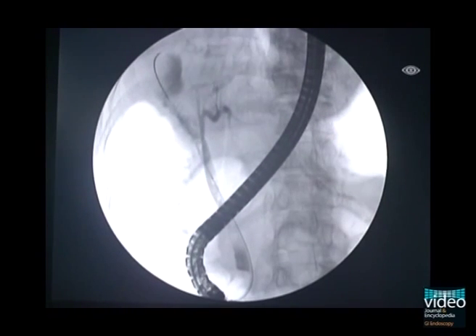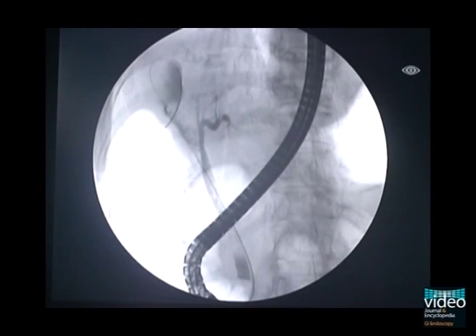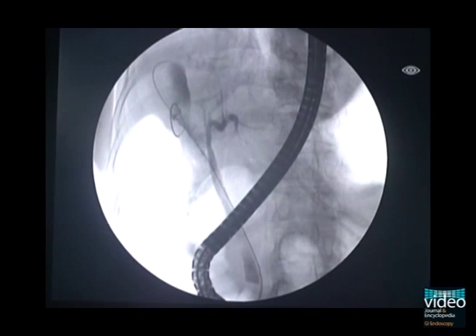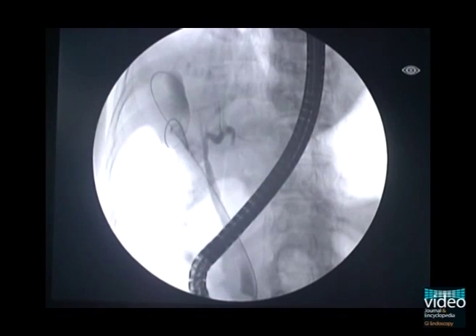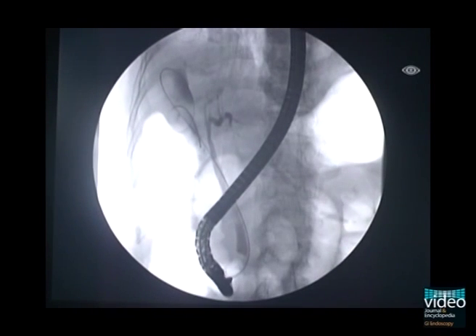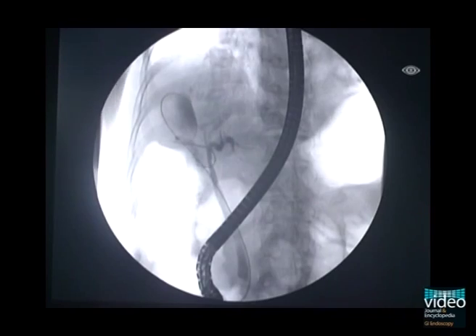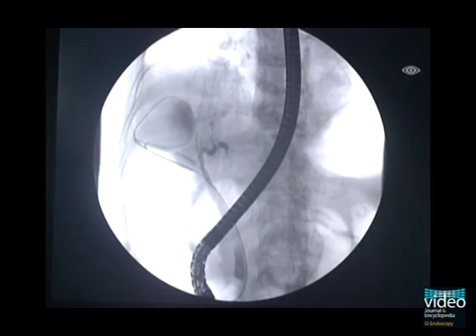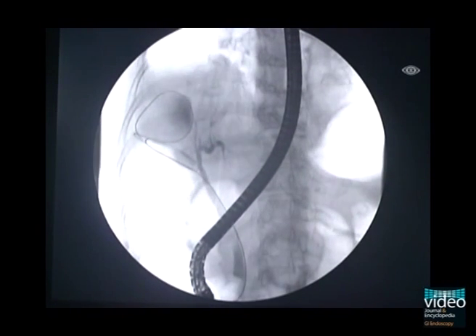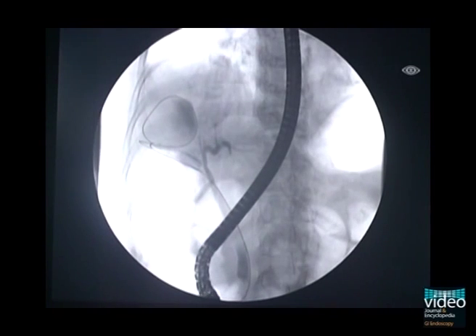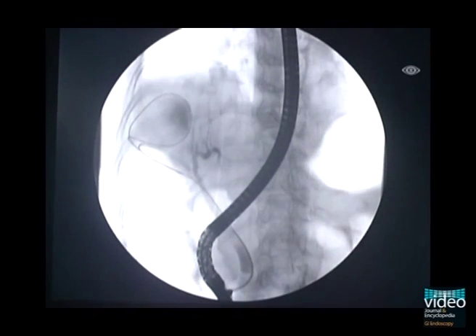In this case, we attempted frequent insertion and withdrawal of the guidewire to introduce it into the gallbladder. To perform successful procedures, experienced endoscopists and skilled assistants are needed to control the guidewire. To coil the guidewire into the lumen of the gallbladder, the papillatome needs to be pushed into the cystic duct and then the guidewire is inserted into the lumen of the gallbladder, as shown.